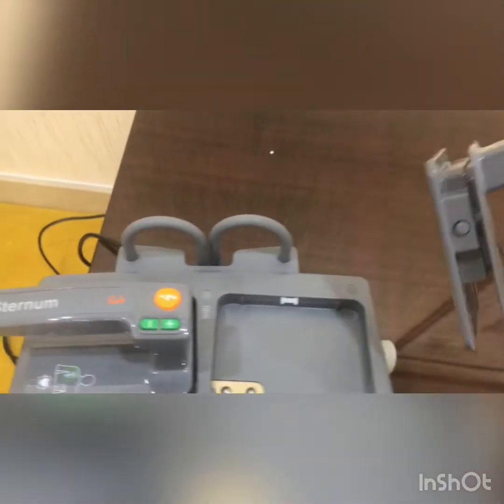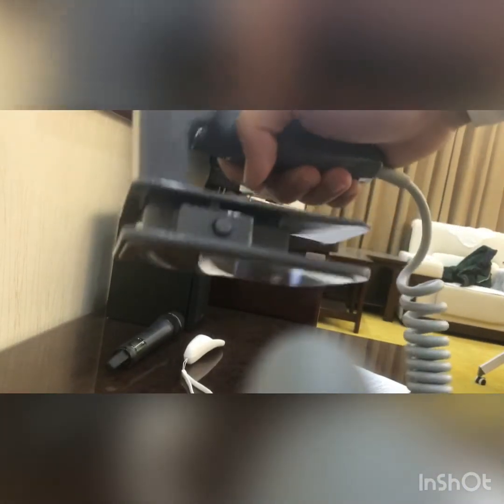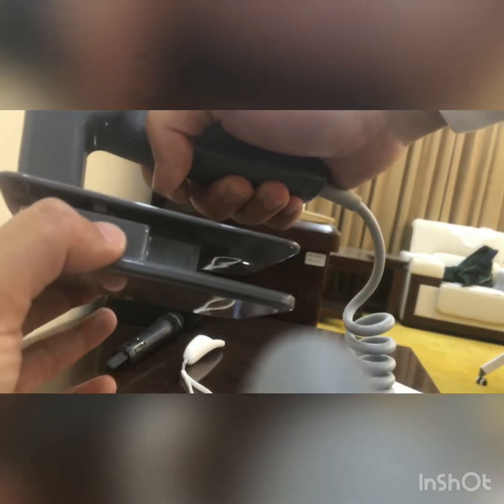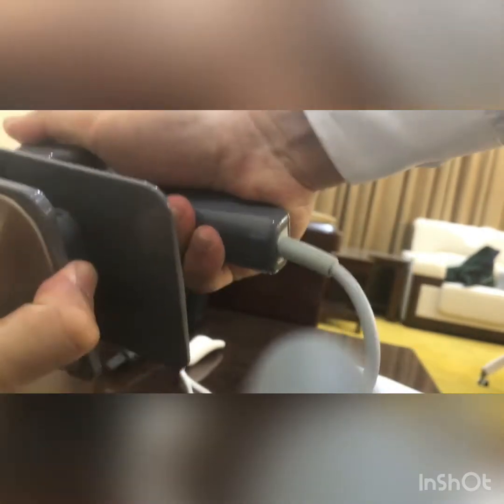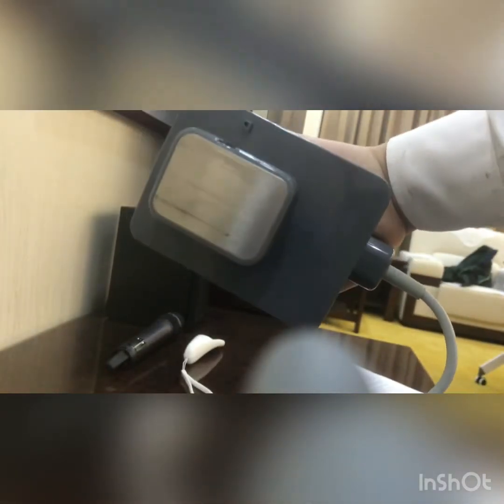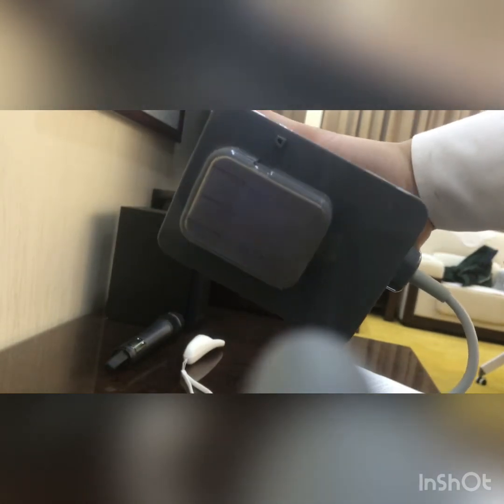Okay, now let me show you how to remove it. Okay, as you can see, press this here and as you can see, this is a pediatric one, the pediatric paddle.